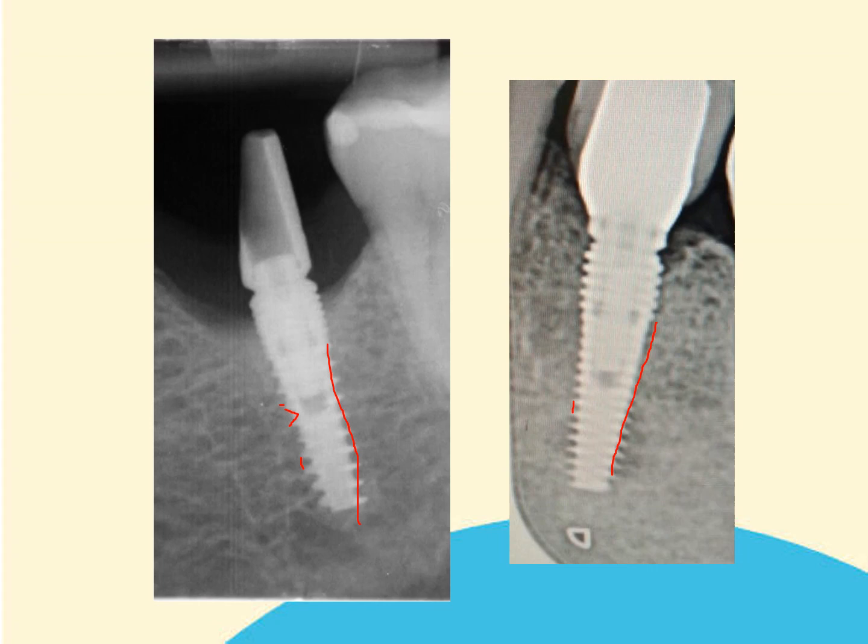So the next thing to look at is the detail of the implant abutment interface. Now, if we look at the Series 2, this is a platform switched type of arrangement. However, there is no gap at the implant abutment interface. The abutment sits flushly on the implant platform. So at this level here, the abutment sits flushly. And also there'd be a 45 degree taper from that abutment going in, and then we'd have our hex positioned like so, our implant hex here. So this would be a Series 2 type of connection.